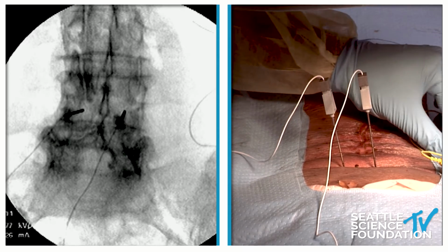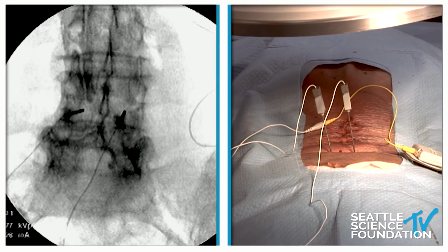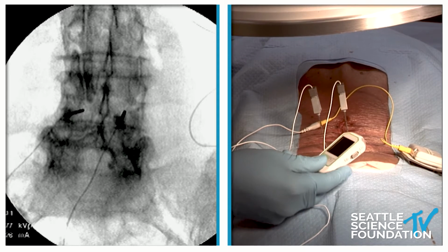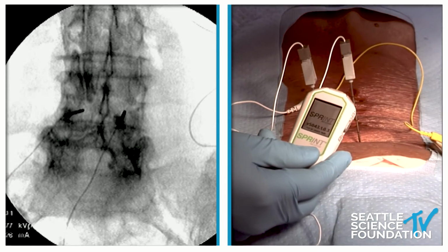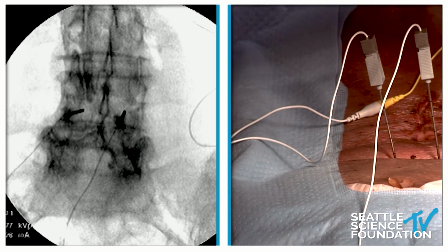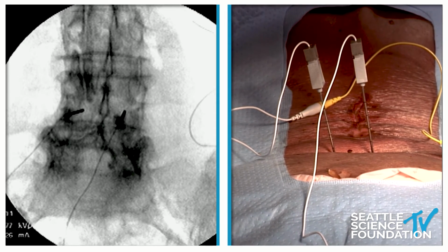So I've got these connectors. Mason's next to me, and what he's got is a remote programmer. I don't know if you can come into the screen here, but we can show you what this looks like. Basically, it follows an intensity curve that is proprietary, going anywhere from 0 to 100. And so what we look for is multifidus twitch as we start to increase. And we can look for this via two ways. One is seeing the needle twitch, and the other is via ultrasound. We can see the changes in the myofascial layers. So obviously in this cadaveric patient, we're not going to really appreciate that twitch, but nonetheless, we're just telling you this is how we would test.